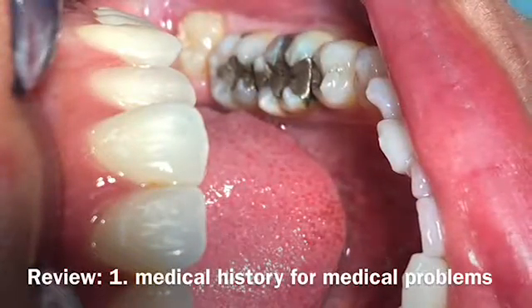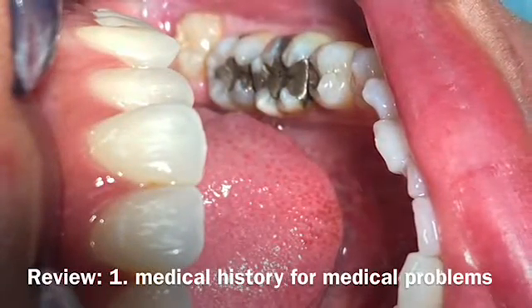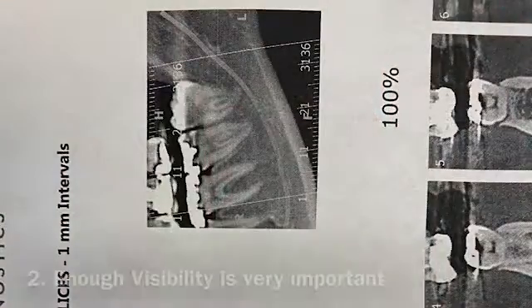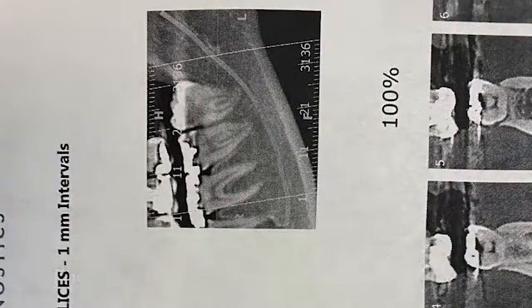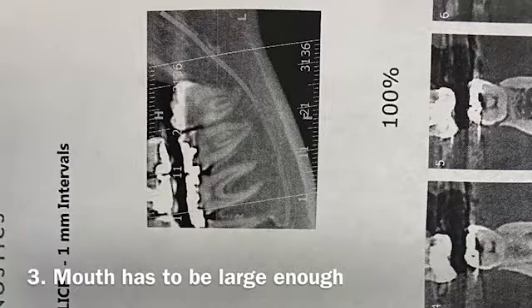The first thing I would do is make sure that you have visibility and access from the mouth. If the mouth is too small, don't mess with it — refer to a specialist. Better to do it that way: save your time, less complication.